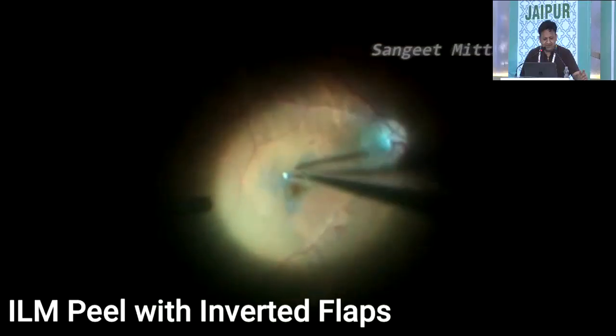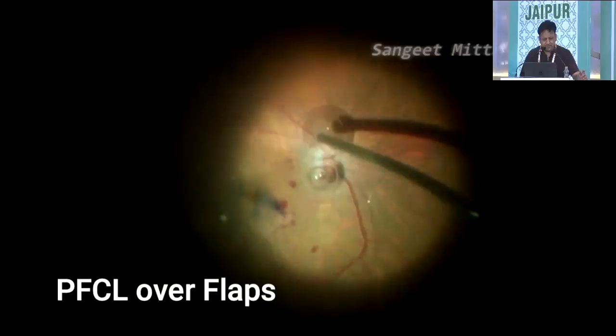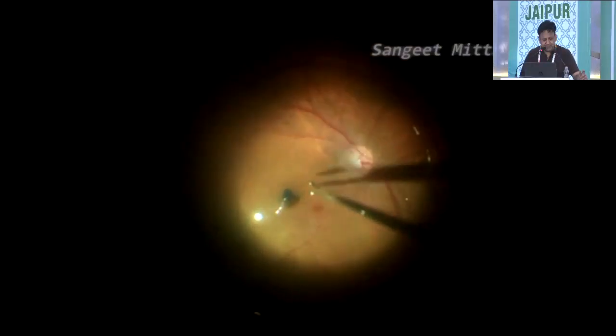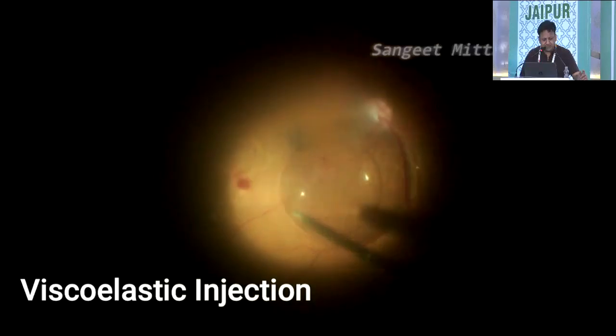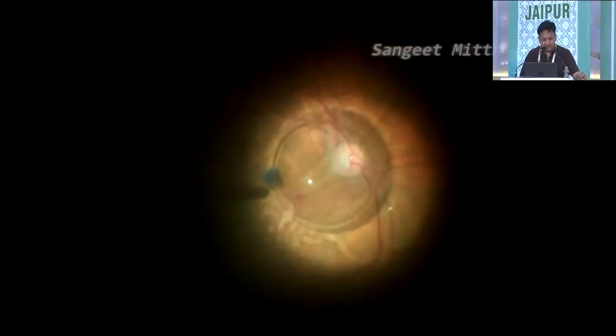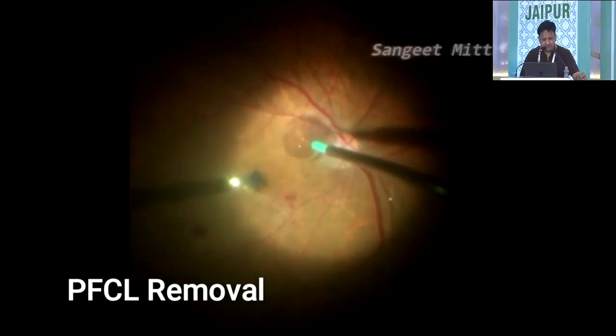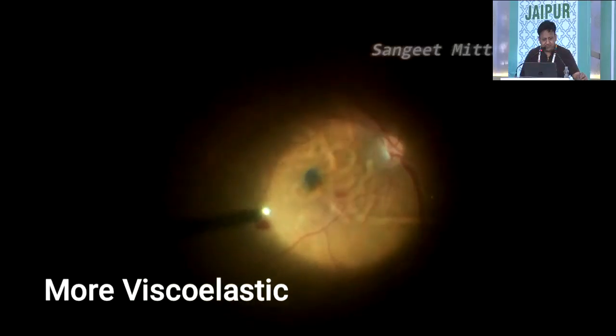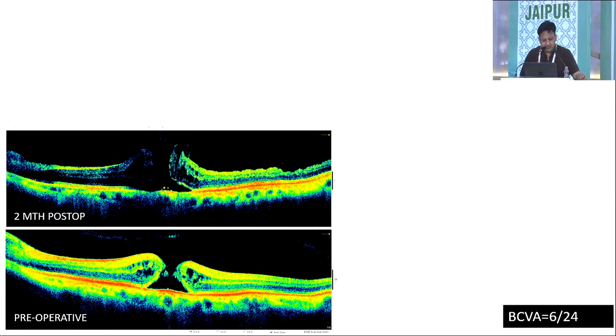ILM flaps were made and inverted over the hole beneath the PFCL bubble. Viscoat was injected around the bubble. PFCL was aspirated slowly and more viscoelastic was injected over the flaps. Closure was done without any air or gas tamponade. So this was 2 months post-operative. The hole was still open, but the flaps were still lying over the hole.